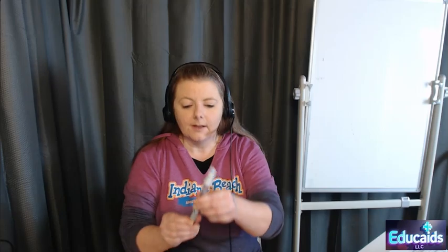Now, one of the reasons why we say that insulin is such a high-risk drug is that the dosages are so small and can have such a big effect on our patients. You can see the safety is engaged there. I'm going to try showing you guys how much. So we're going to crank it up to 2. There we are.